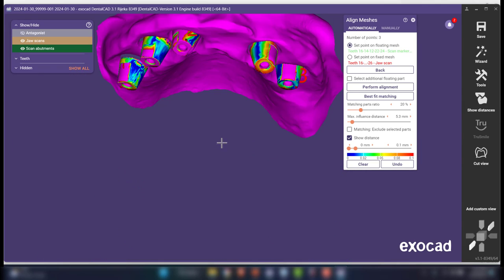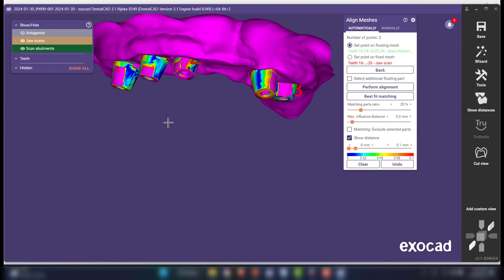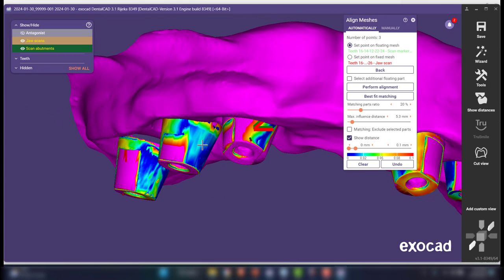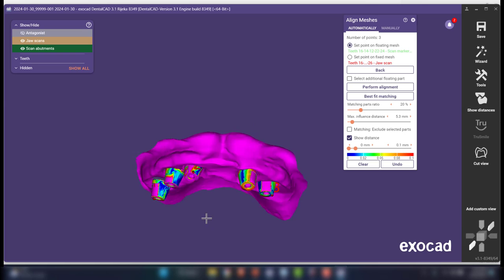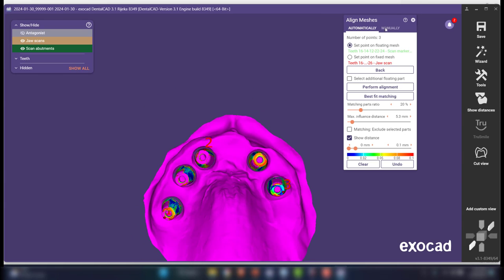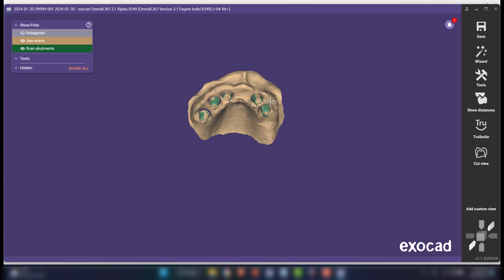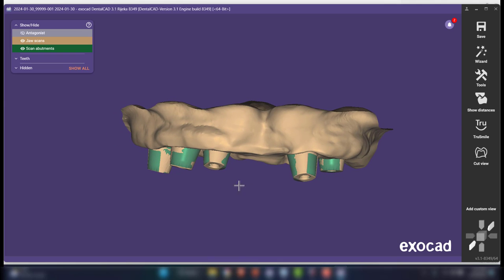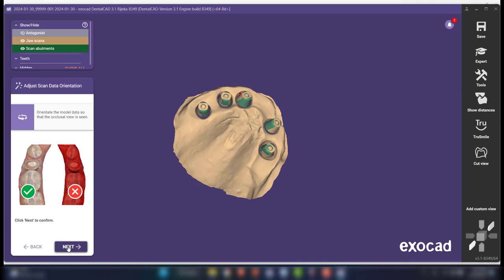And so this is what you want to see. You want to see that tight adaptation between the two models, but you fully expect to see some error here because again, we're correcting this somewhat inaccurate intraoral scan with the photogrammetry scan bodies. So that's what you ought to see. If you look at that and it looks good, just click the X. And now you've got this data pulled into the case. At this point, we can jump back to the wizard and proceed with our workflow.